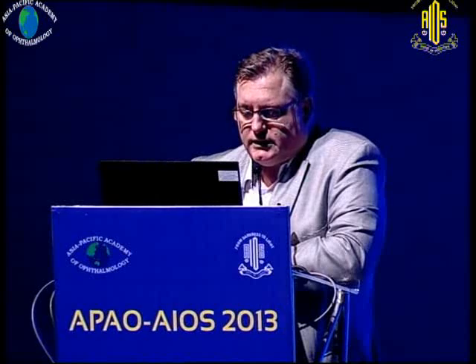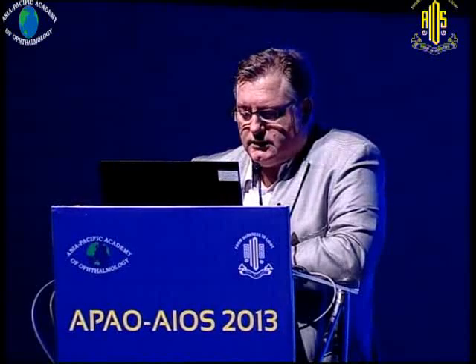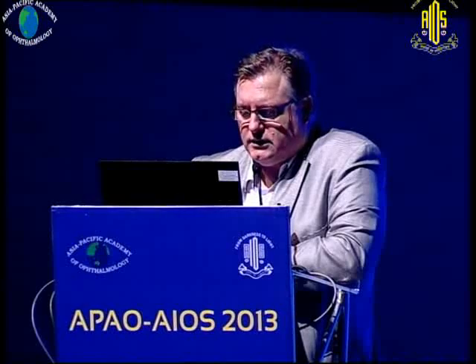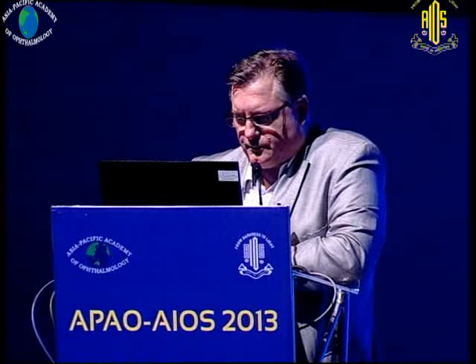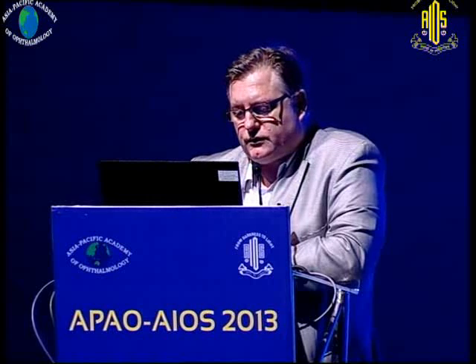They got bilateral LASIK treatment, no monovision, it's the same treatment for both eyes. And after 6 months, the nomogram of the sphere was adjusted. Here are the spherical equivalent and also sphere and cylinder. You see they were on average hyperopic and afterwards slightly myopic with a refraction. Here you see that also, and this was stable over the follow-up period of 6 months.